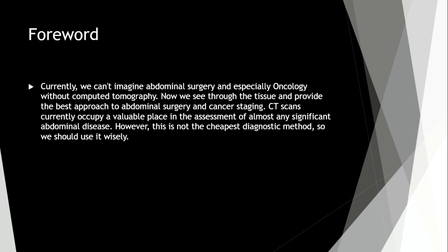Currently we can't imagine abdominal surgery and especially oncology without computed tomography. Now we see through the tissue and provide the best approach to abdominal surgery and cancer staging. CT scans currently occupy a valuable place in the assessment of almost any significant abdominal disease. However, this is not the cheapest diagnostic method, so we should use it wisely.